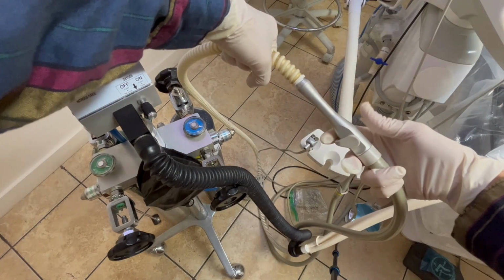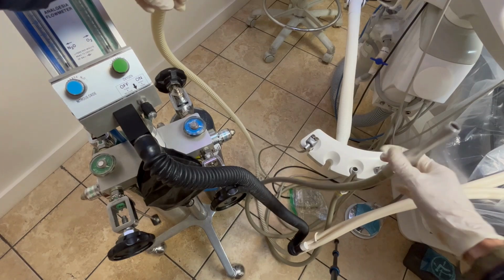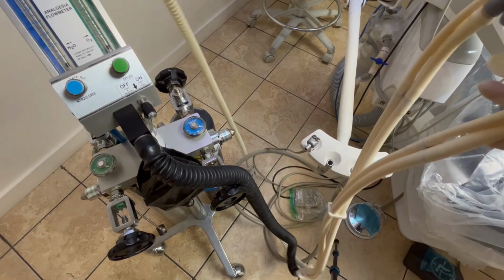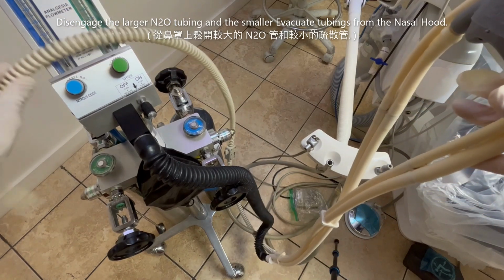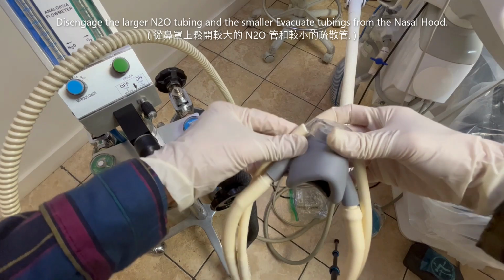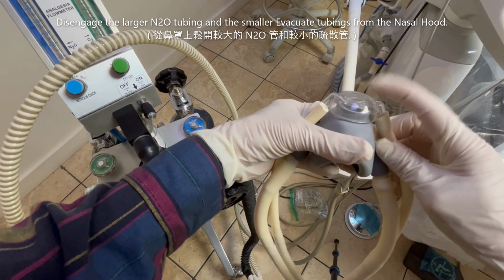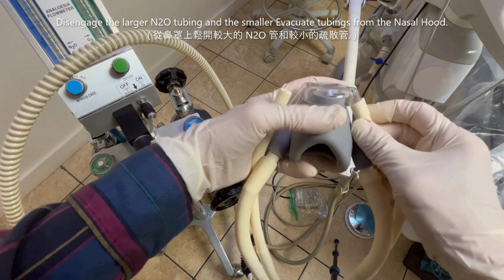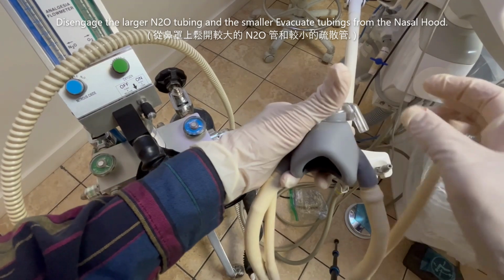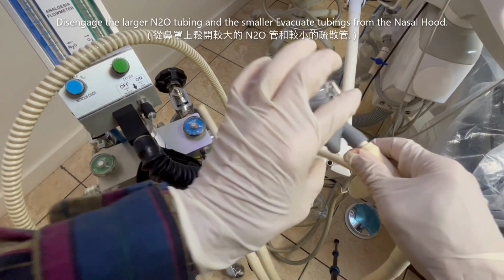Don't forget to turn off the vacuum here and remove the vacuum and the hose here. This part, simply disengage or remove the tubing from it. Be careful, this plastic is very fragile. Don't break it. A lot of times, assistants do not know how to do it. They just apply different force and break and crack those.